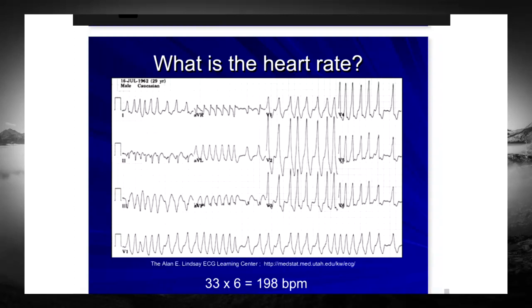So anytime you go to a clinic and they ask, all right, what's the heart rate? You put your finger on the pulse, look at your watch, count for 15 seconds, and multiply that by 4. If you decided you're only counting for 10 seconds, you would multiply that by 6. That is exactly what you're doing here. You're just looking at the pulse as opposed to feeling it.